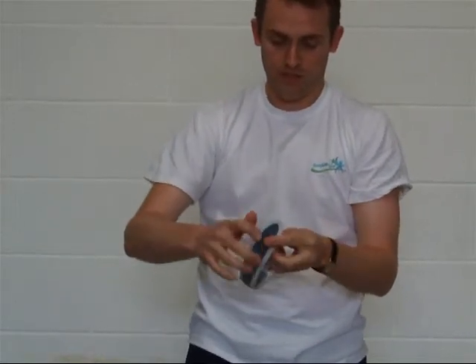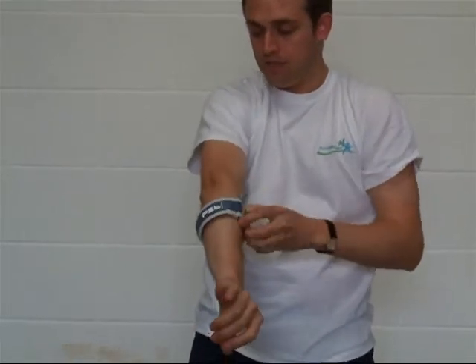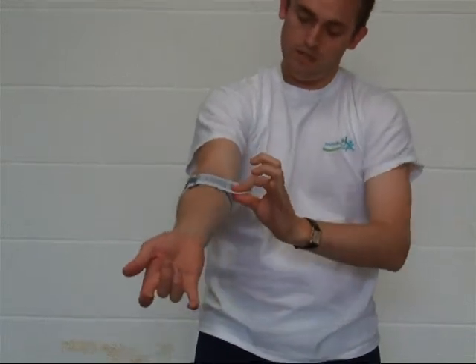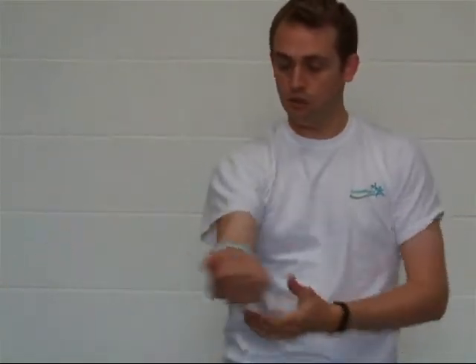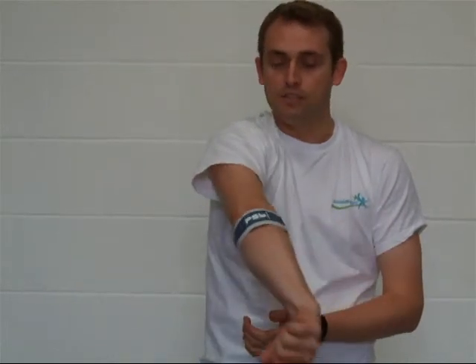Simply slide it just below your elbow, do up the velcro strap, and then that sits comfortably — it doesn't restrict movement at all but relieves the pain of tennis elbow. So that's the PSB elbow brace.